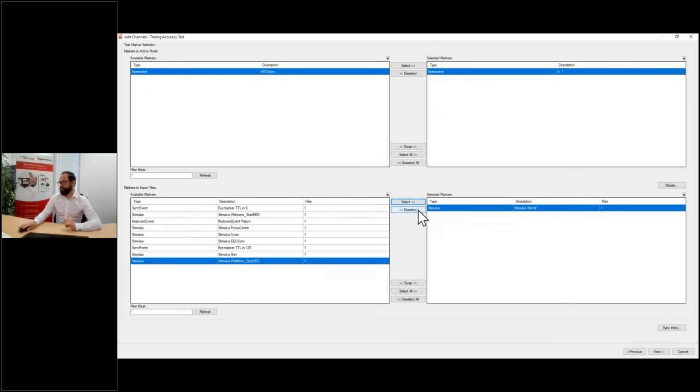So I select those. StimW, because W for white, because this is when the photosensor picked up the very bright white spot on the bottom. So we called it that way to have a very clear stimulus that we can identify here. There's also another one that is just called Stim. That's when the photosensor was picking up the black surface. So that's the other 50 patterns.